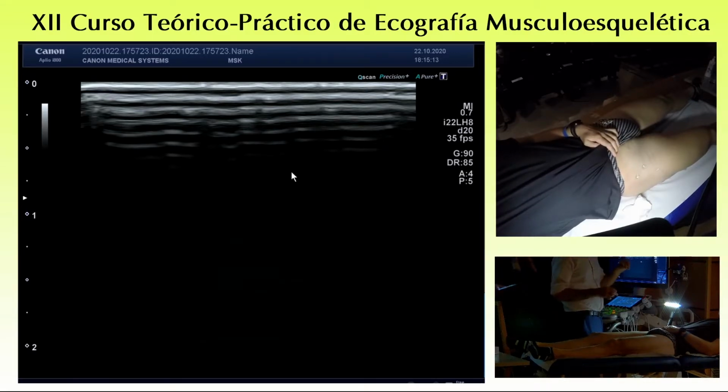To see the nerves, you have to look there, and then along the inguinal canal. Moreover, for diagnostic purposes or for injection, there is no other spot than this plane. Okay, you aim at the plane. Injecting there, you block all the nerves basically. Okay.